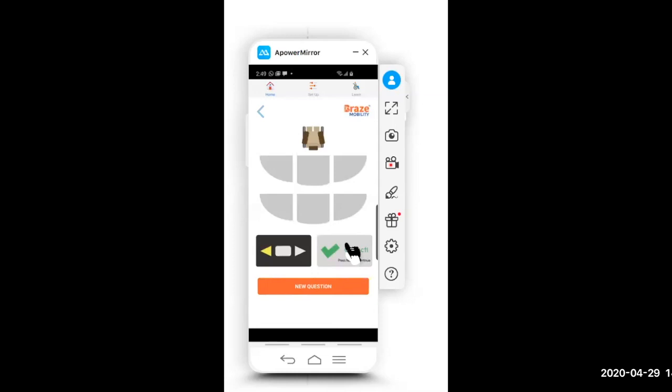We've thought about this a lot, especially in the context of people learning to drive, and what the role could be of a game like this that could potentially also give positive encouragement when they successfully avoid an obstacle. These are all things that we're working on, but I wanted to give you a sneak peek of this. I also wanted to mention this as a potential tool for therapists, especially on this call, if you're doing training and assessment with new users. This might be a really handy way of figuring out whether cues could be a useful addition for the person to be able to safely navigate.